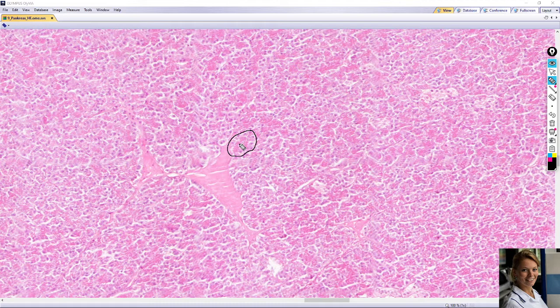These granules contain the precursors of several digestive enzymes that are secreted into the duodenum. In the initial part of each excretory duct of the acinus are visible very pale centroacinar cells, which are located in the middle of the serous acinus.